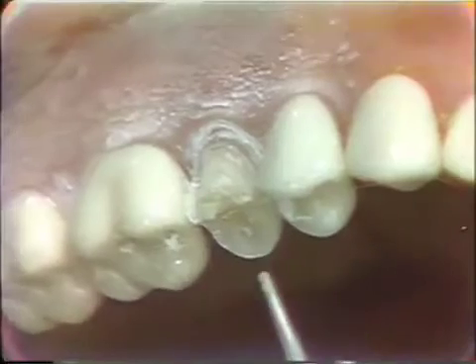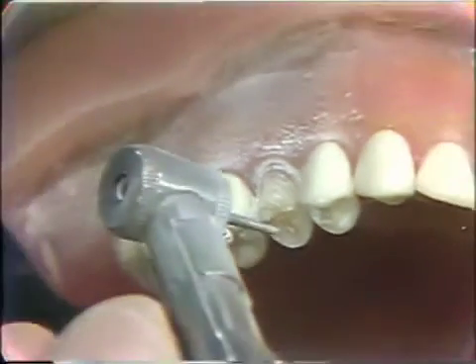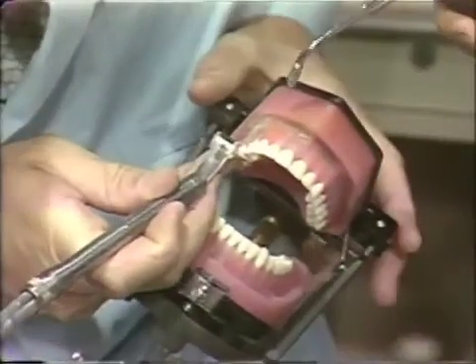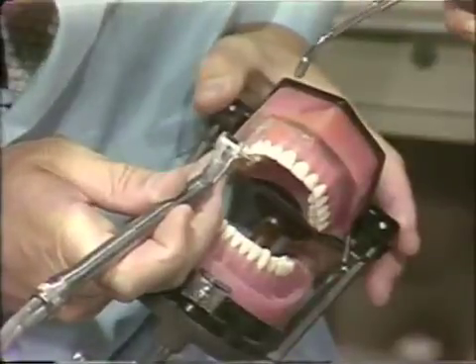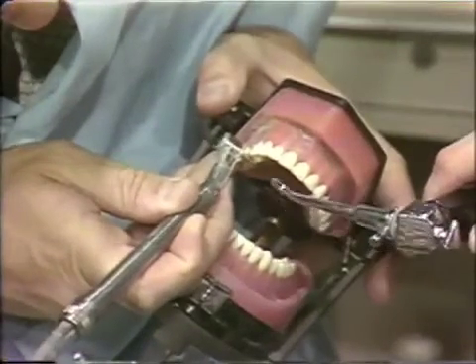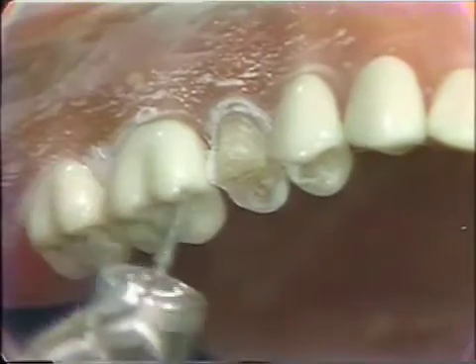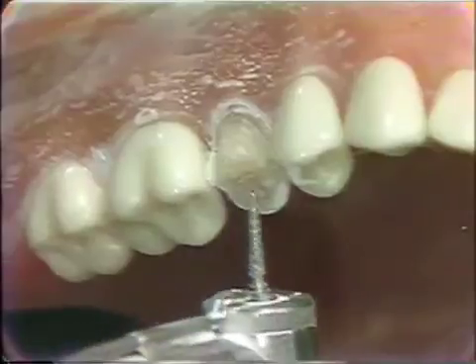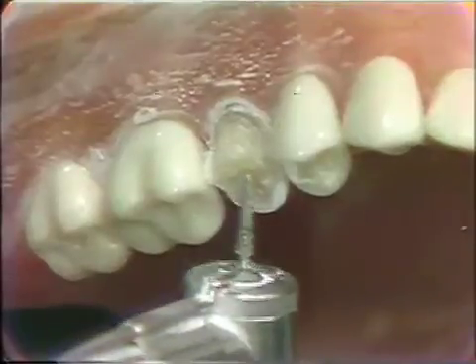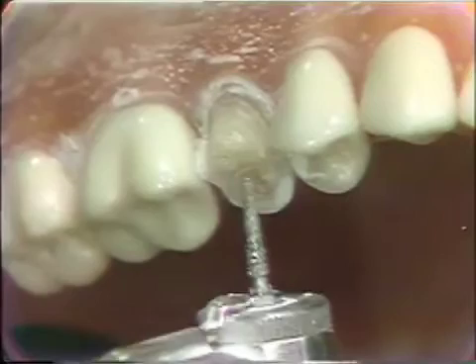Then we'll turn the diamond around and coming in from the buccal we can develop that part of the cut. We can move the diamond then to the lingual portion and bevel that aspect of the lingual. It's important that we maintain the contour of the occlusal surface — if we have too much thickness of porcelain, the excess glass tends to absorb forces applied to it and would tend to fracture rather than transmitting the force to the metal and tooth structure underneath.